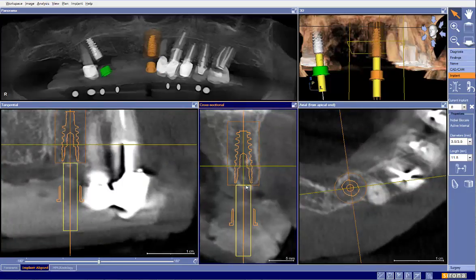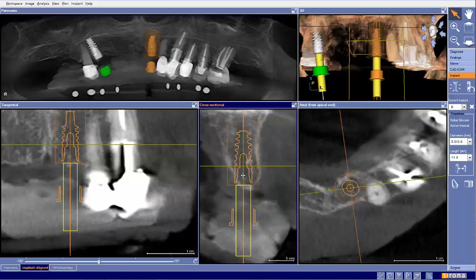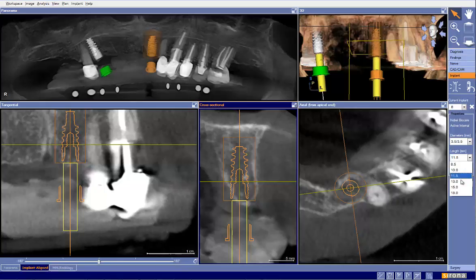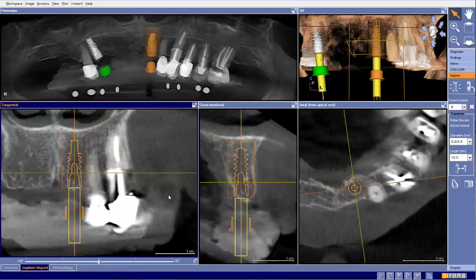You want to make sure that obviously we keep the implant in bone. The buccal plate is the key. You want to make sure that we maintain that integrity of 1.5 to 2 millimeters of buccal plate. The great news with this particular implant is that you will be undersizing the osteotomy. If I were to use a 3.5 here, I'd certainly try to go to a 13 millimeter implant, and then we can go from there. So hopefully this has been helpful.